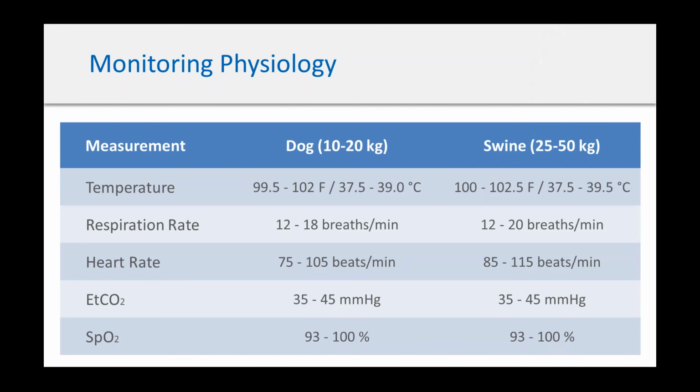We always monitor physiology very carefully, and we think the physiologic monitoring is probably one of the most important things to be able to compare from animal to animal. Oftentimes you're only going to be doing 1 or 2 animals in a day, and if you're truly comparing from one group to the next, you have to be really careful in your day-to-day experimentation so there's not too much day-to-day variability. The best way to do that is to control the animal physiology.